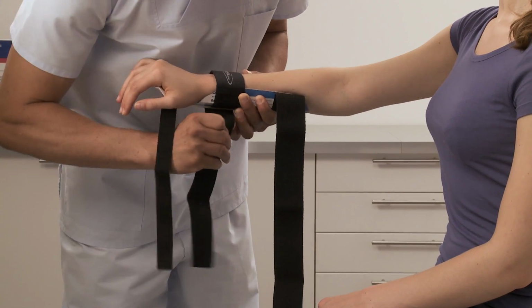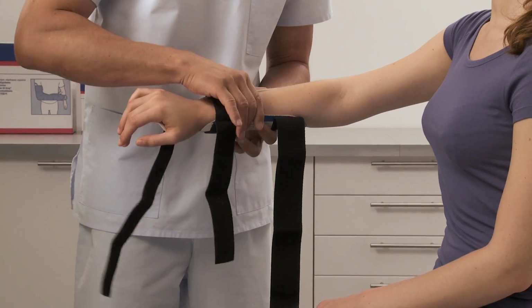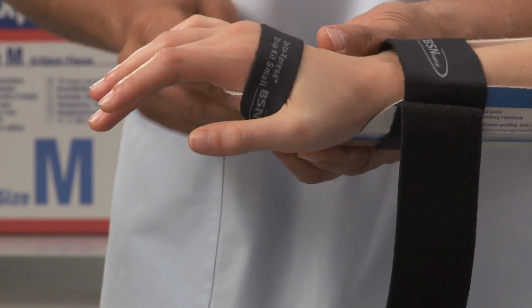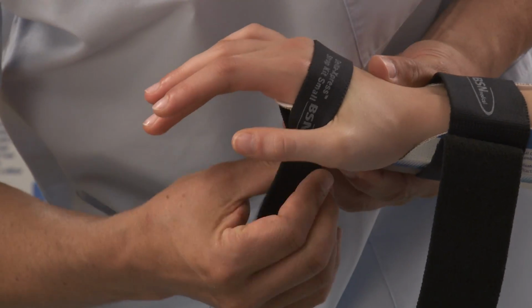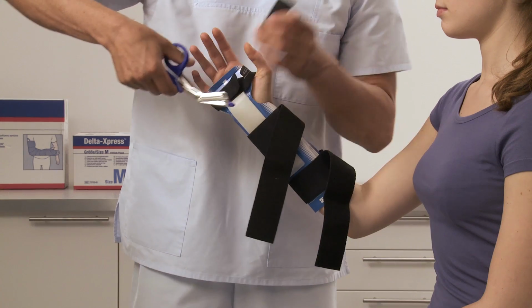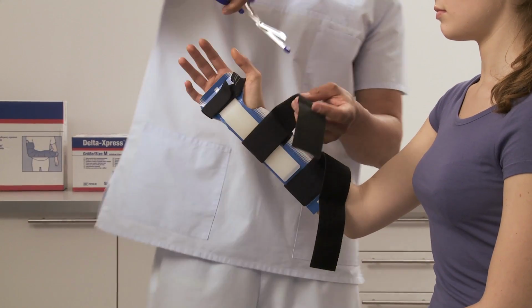First, apply 1 large strap at the wrist. Then apply the second large strap at the proximal side of the lower arm. The small strap is applied around the web space between thumb and index finger. Check the tightness of all straps again and adjust as necessary.